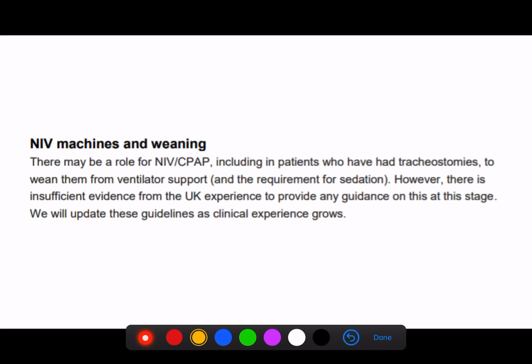Because these patients have such a fluctuant clinical course, I don't think it's wise to extubate these patients onto NIV or CPAP. I'd rather extubate them onto simple face mask oxygen, and if they're not ready to do that, then keep them intubated. That's my general feeling. However, the role for NIV and CPAP in a broader sense is still being understood.